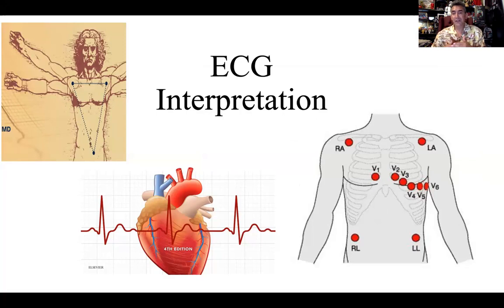There are two ways to conduct an ECG, right? Electrocardiogram. So the simplest and effective is what we call the 3 lead. The more elaborate, more detailed information would be the 12 lead. So this is just kind of a picture. This is the fundamental concept behind a 3 lead sort of ECG.